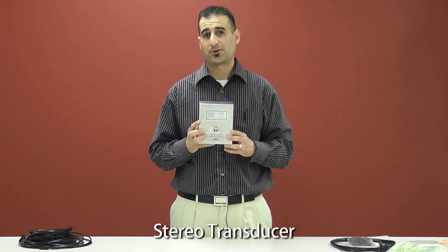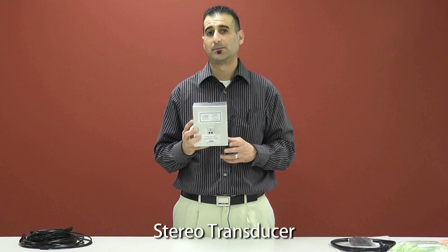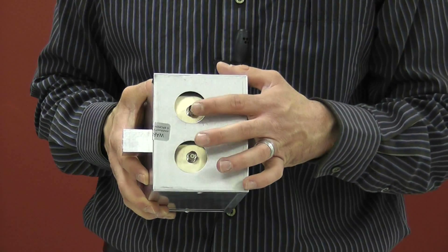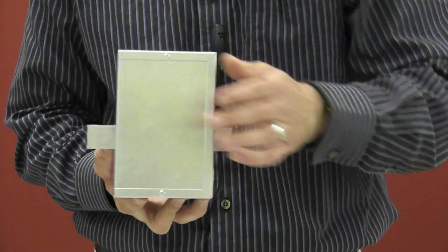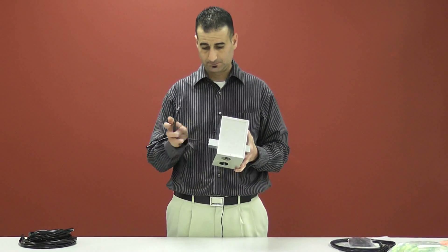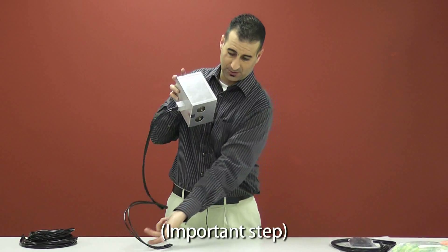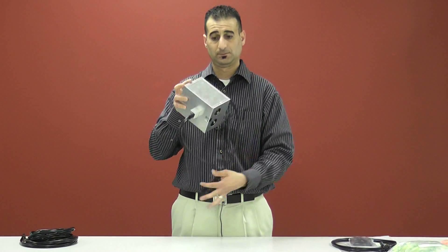This is our stereo transducer. This is the only piece of equipment that will be placed in the MRI unit. The transducer will have the BNC and RCA connections, and two ports for the pneumatic headsets to be plugged in. These ports are designed to use your adapters, which also give you the capability of listening to two headsets at once.